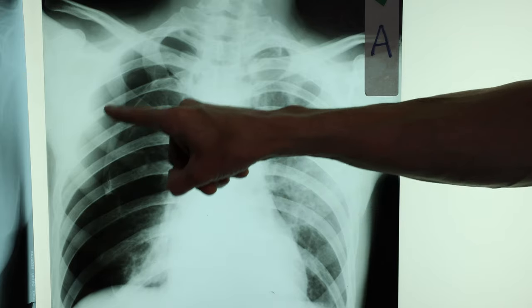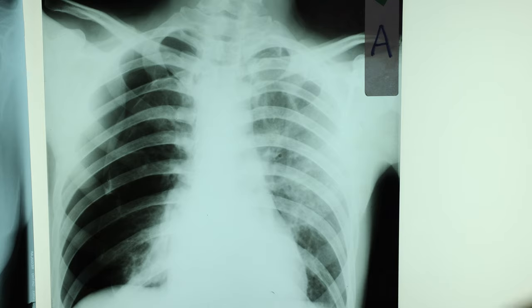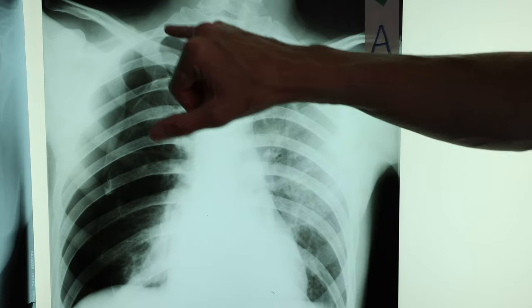It looks like we've got a bit of a pneumothorax so the lung has been pulled away — not great for the patient, but very helpful for you.